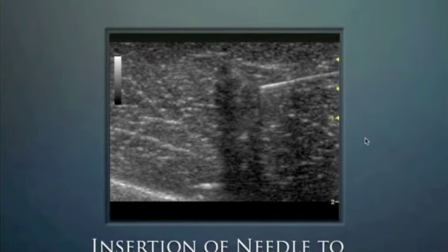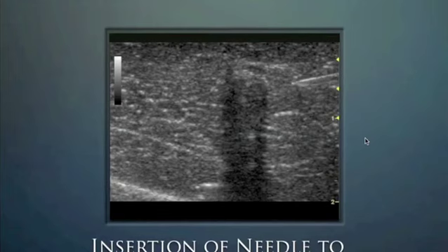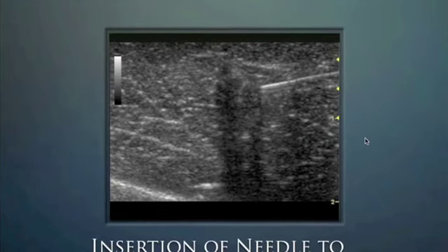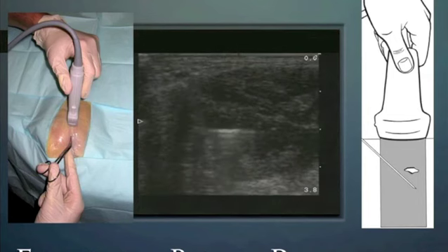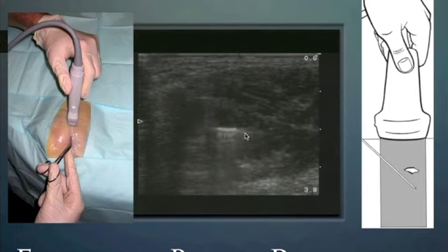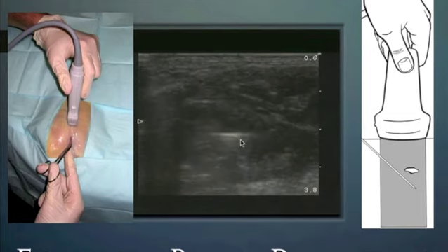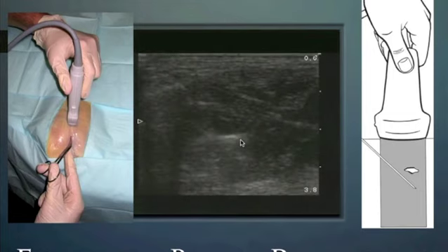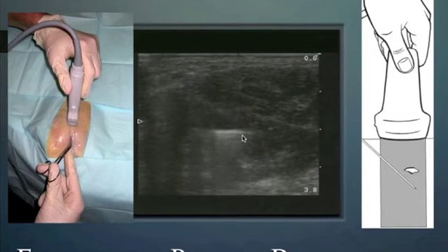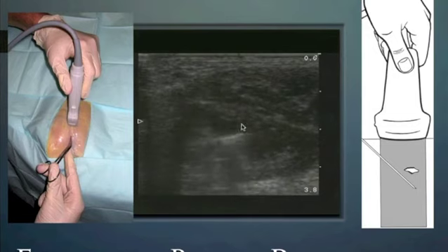This patient had a needle break off in their buttocks during an immunization years ago, and they came in because it was particularly discomforting on that particular day. When they arrived, we took a look with ultrasound and found this needle about 2 centimeters. These are 1 centimeter hash marks. So we get down to about 2 centimeters below the skin line.